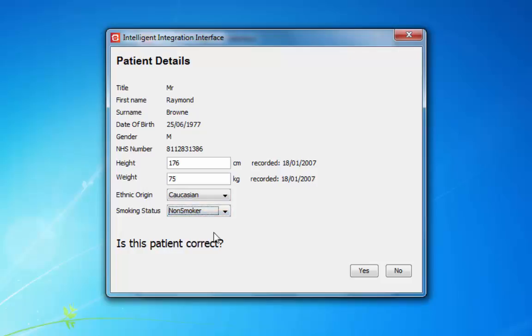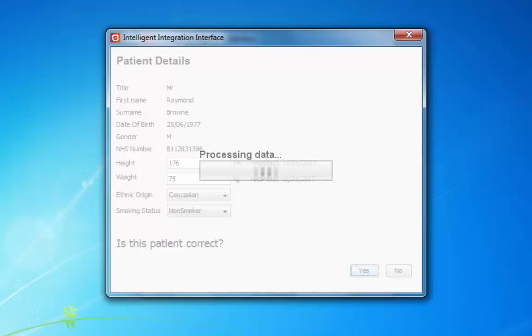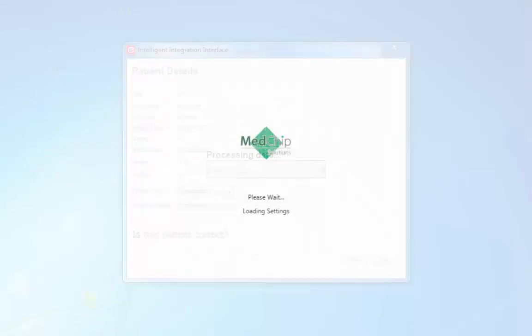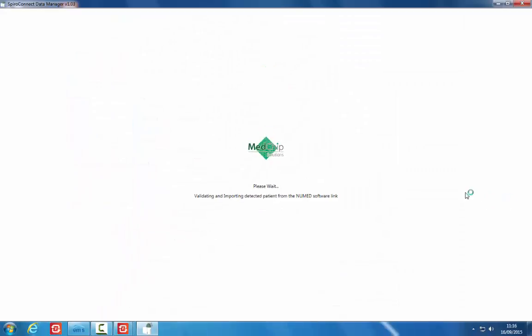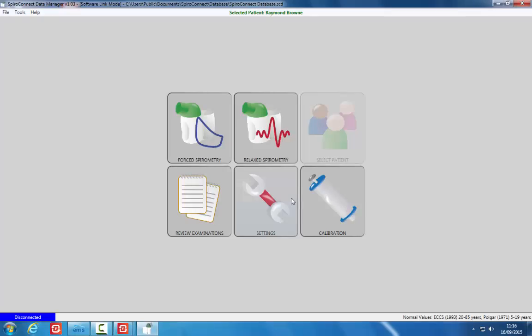Once all the details are correct, confirm by clicking Yes. The patient details will be passed to the SpiroConnect software.